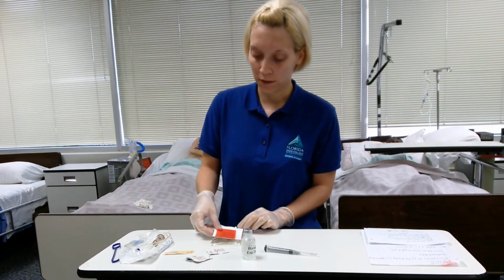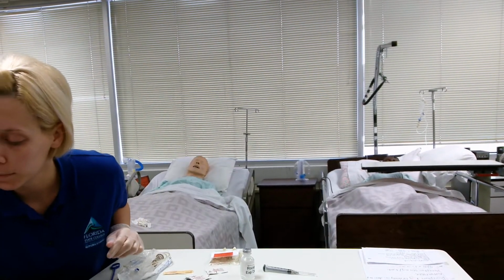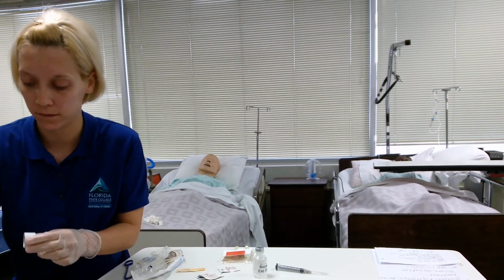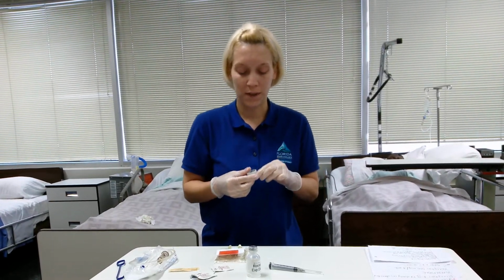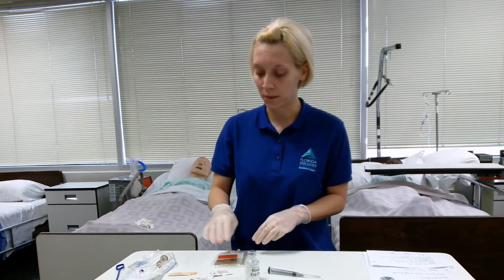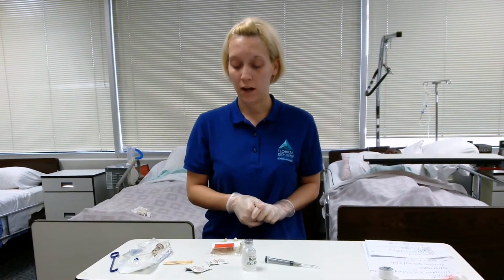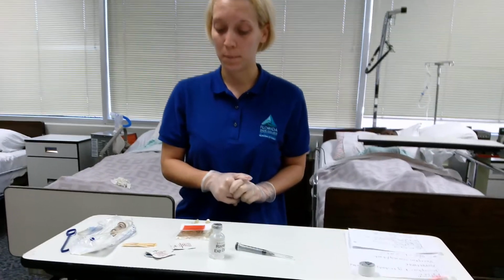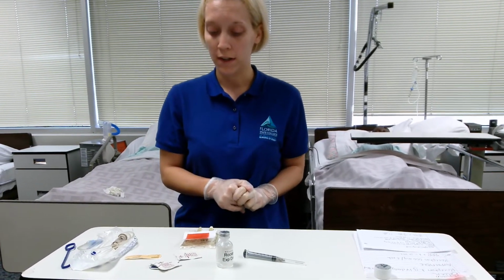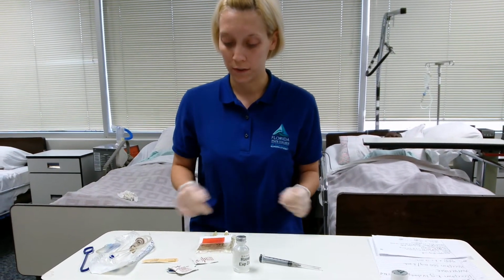I'm going to label it with, do we have tape here? I would have my tape ready. I'm just going to pretend, but I would label it. I'm going to put my initials, date, time, the type of antibiotic, the dose, the patient name, the room number, and my start time, which I'll do after in my initials.